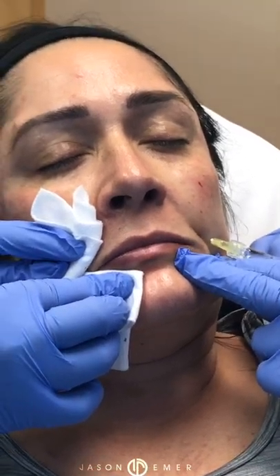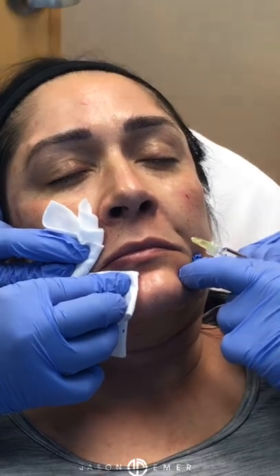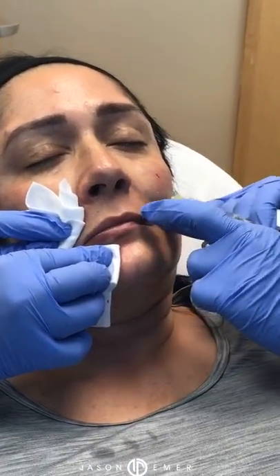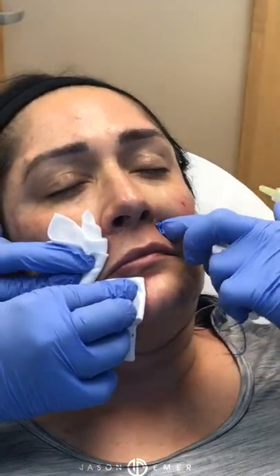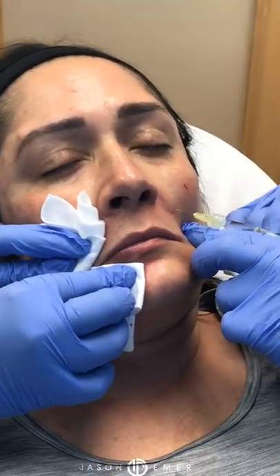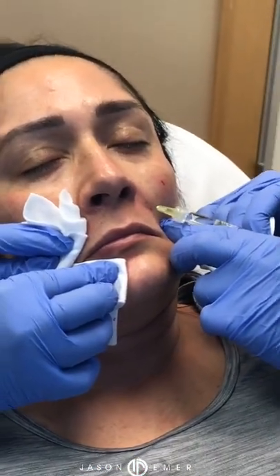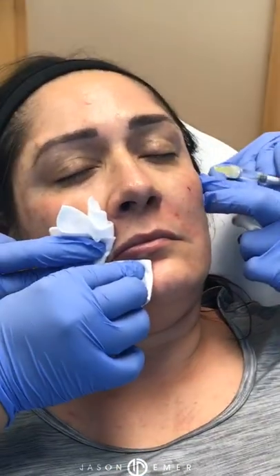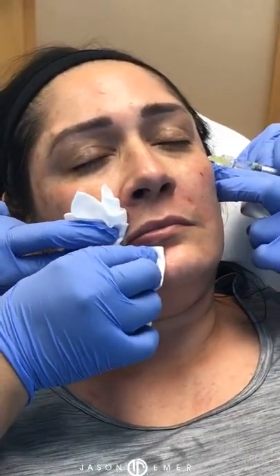And what'll happen, uniquely with this filler, is the filler integrates directly into the skin. It's the only type of filler that's known to do that, where it has exact dermal integration. So you can do these little pop-ups, and then within a few hours, it becomes the skin. It looks really soft. It's a nice natural look for people that don't want to look overdone. Go to the lateral part of the eye.